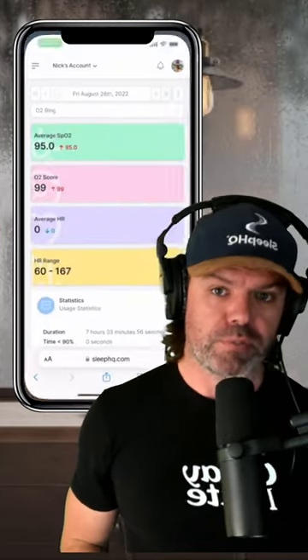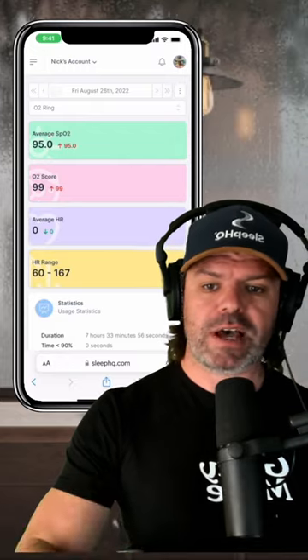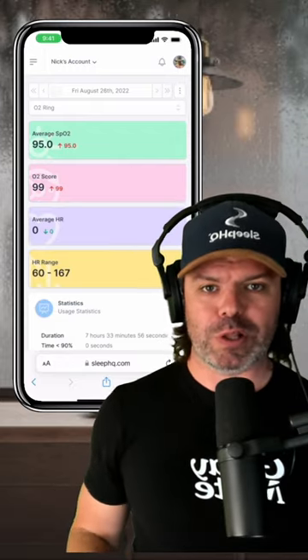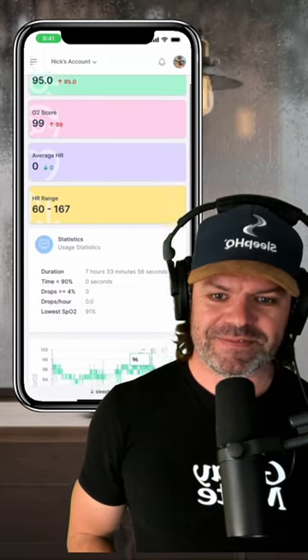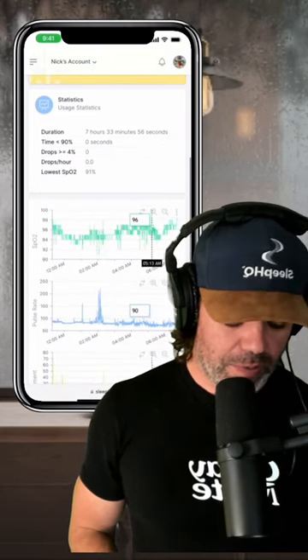When you do, you can bring in that O2 data, your pulse rate data, all that great stuff, and view it alongside your CPAP data. Here's a little sneak peek — really cool stuff.